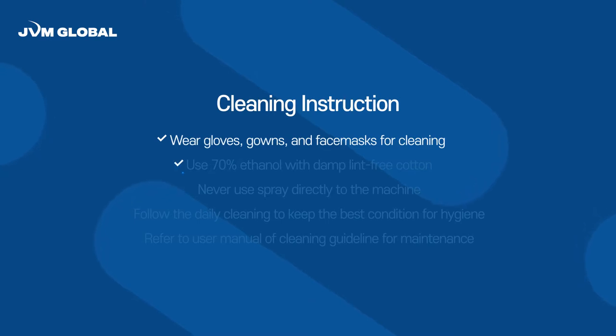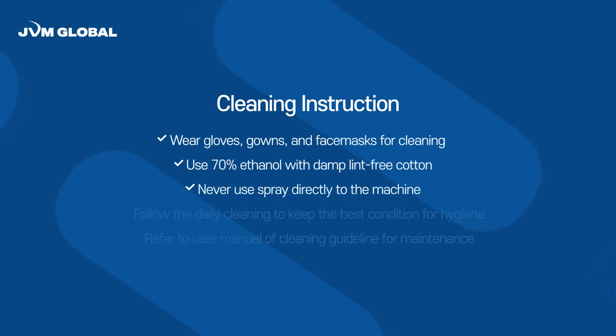Second, use 70% ethanol with a damp lint-free cotton cloth. Third, never use spray directly on the machine.